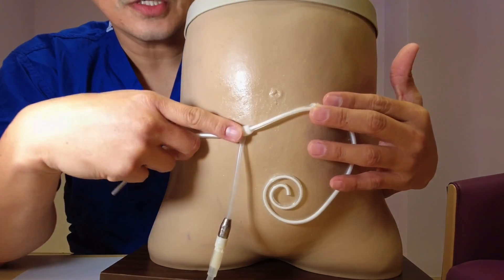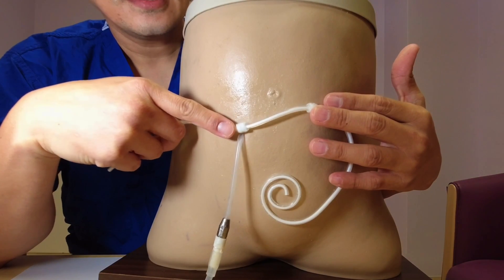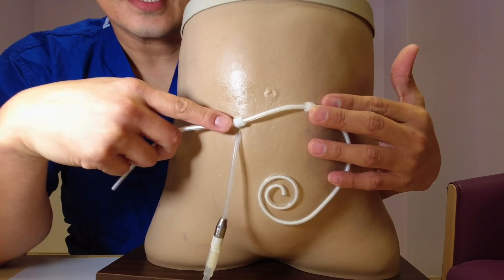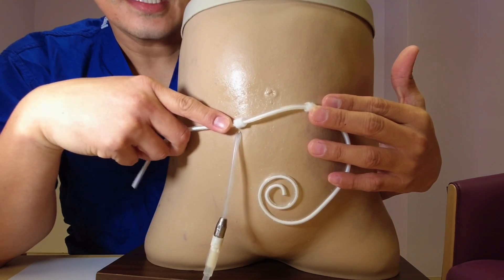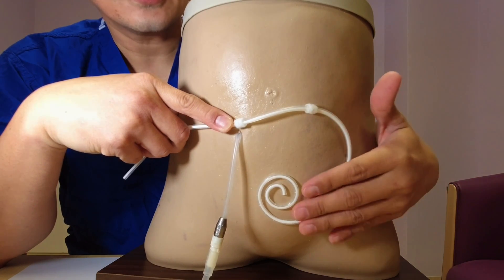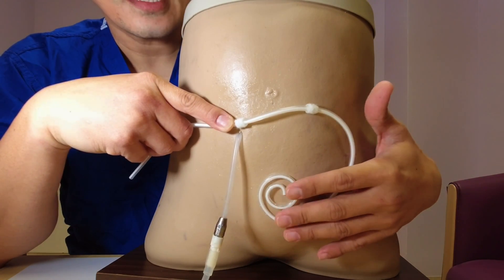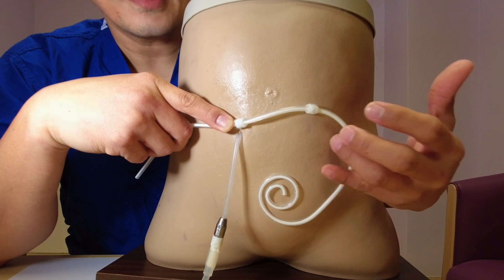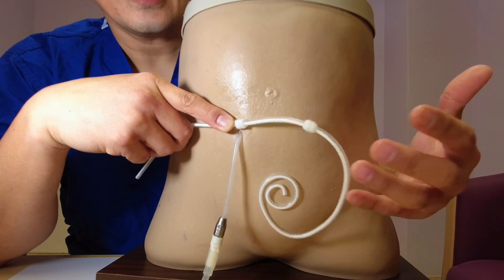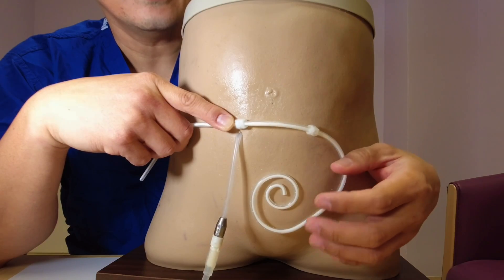Normally, the procedure for peritoneal dialysis takes about four times a day. It's easier to remember during meal times — breakfast, lunch, and dinner — and one at nighttime before you go to bed.